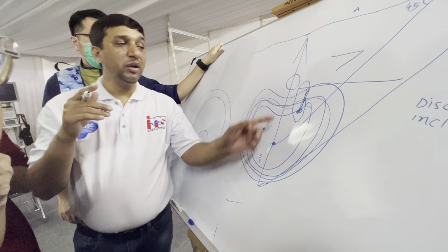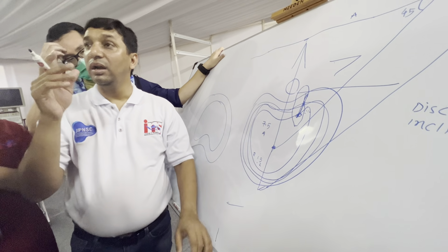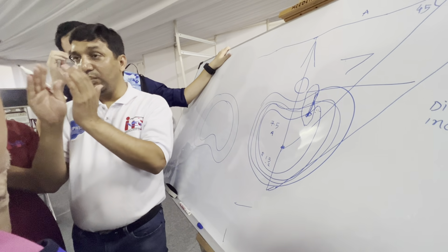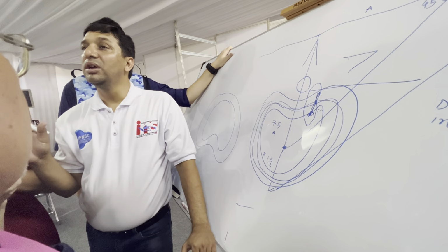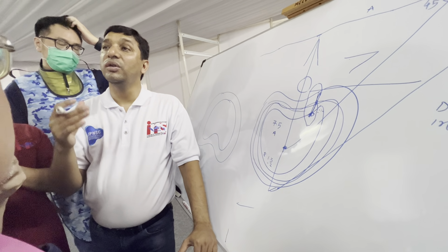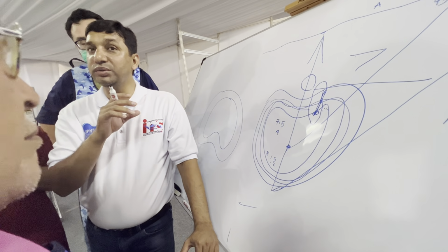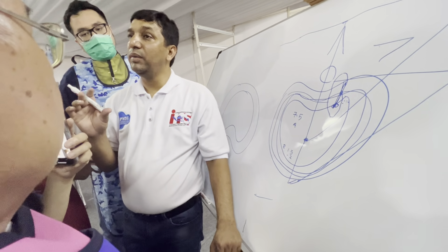So you don't need to go and catch the herniation, even if it is inside the canal. If you have made the neck of the herniation wide, it will easily come out and your job is finished. There is no need to go directly to the canal, because you have the option to do this directly. That is the principle of transforaminal endoscopy.